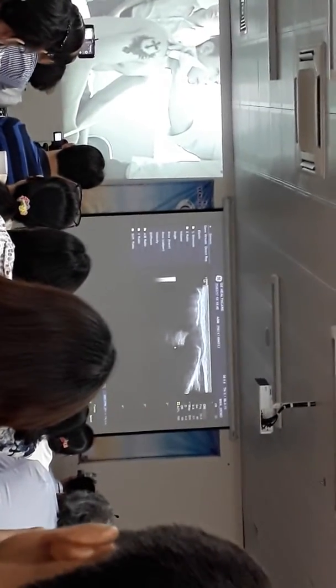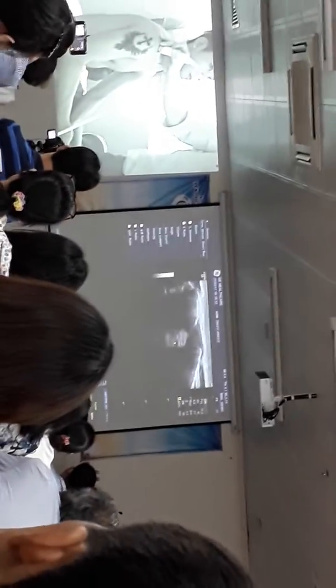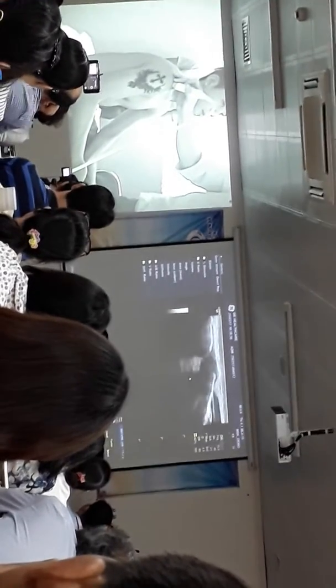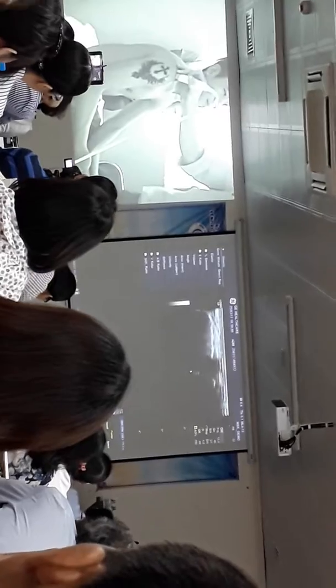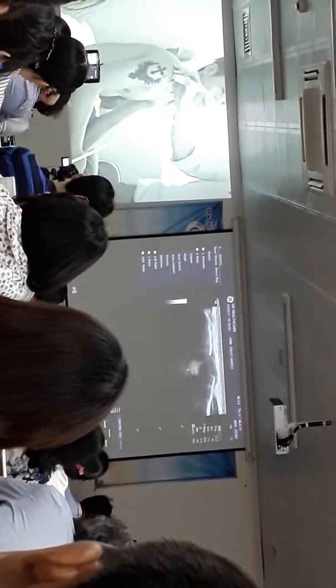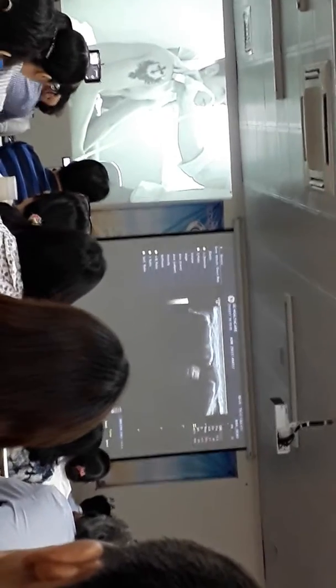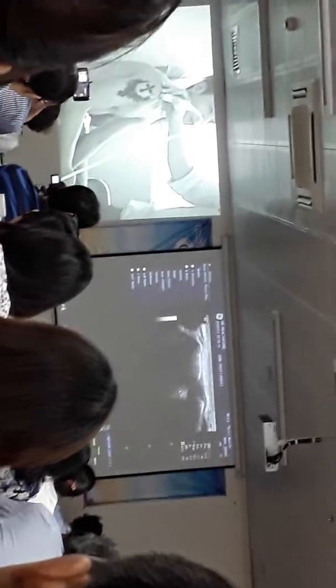From this position, I just push on the patient's joint and ask them if they're sore. Does that hurt? Yes. So just making sure that there's no sclerosis of the bony surfaces as well and no arthritis.